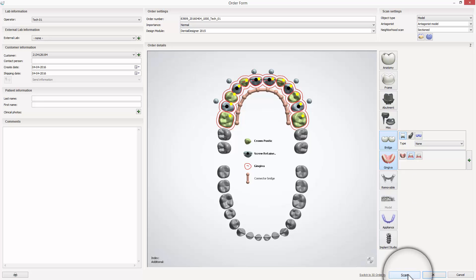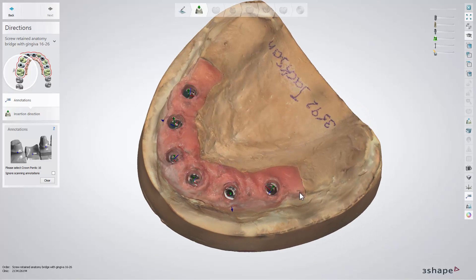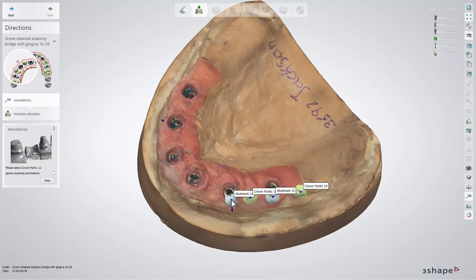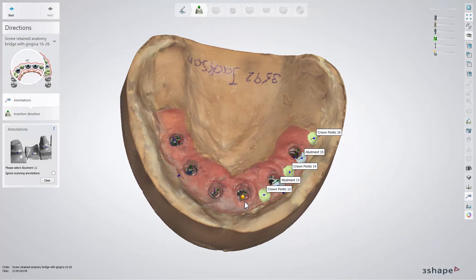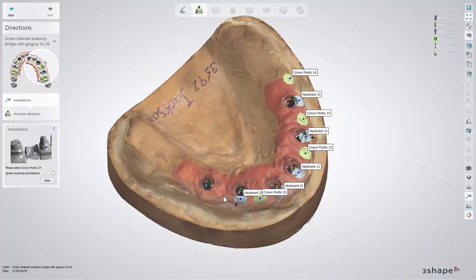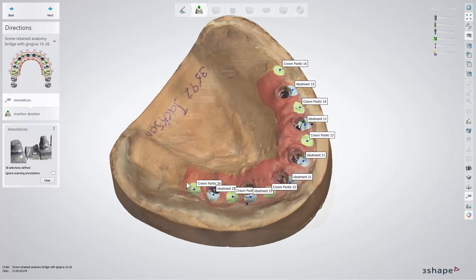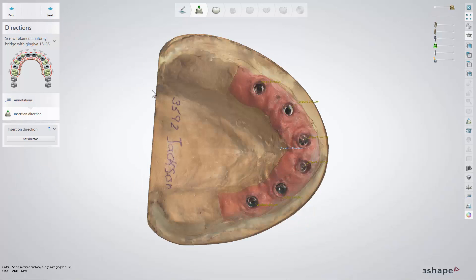Once your model has been scanned, place the annotations keeping in mind that they should always be placed on the buccal side of the gum near the margin. If an annotation has been placed during scanning you can always move it — just click and drag, or select ignore scanning annotation and place it again. Then click next to move to the insertion direction step.